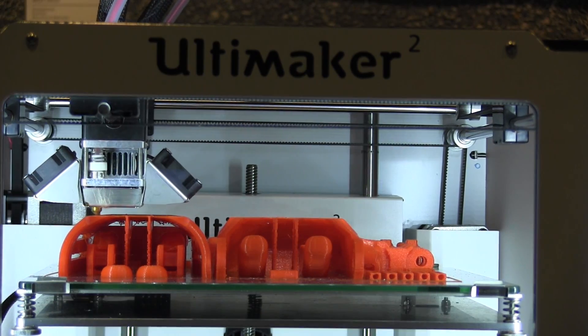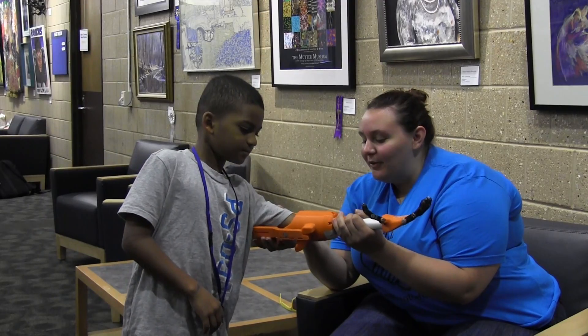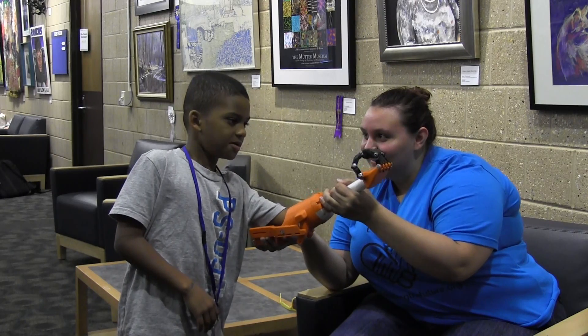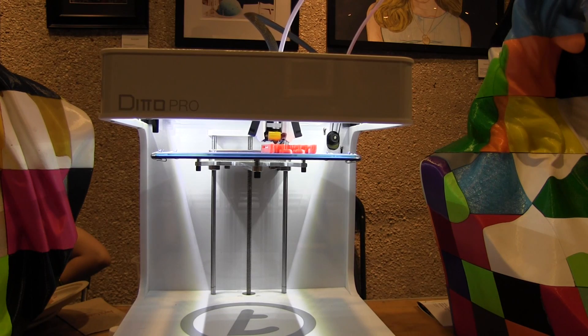Things that I've learned include the different methods you can use — speed, the volume of plastic coming out of the nozzle at one time and how it affects the print, how cooling can affect how it comes out, and whether you want something solid or what type of infill density you want, and how heavy or light it can be. It's really cool how intricate and technical it can get.